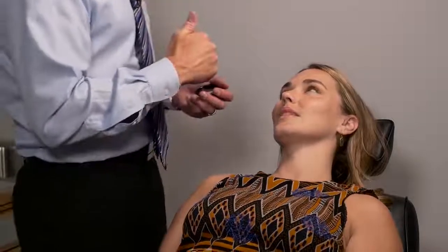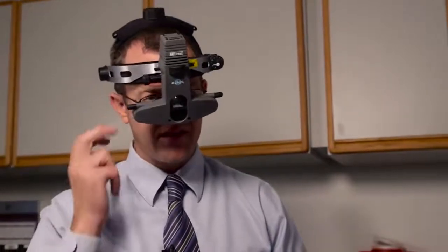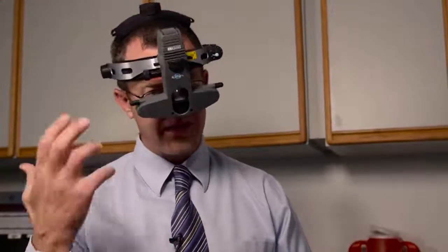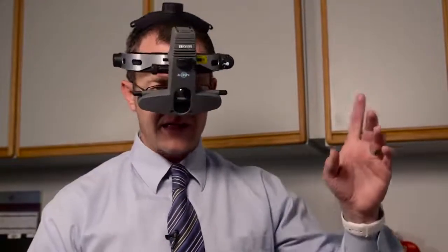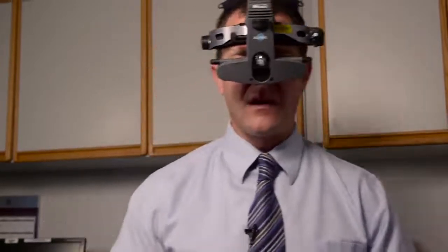As I'm going, I will make a note of where I saw change. Well, I saw a little retinal defect or a retinal tear up at 10 o'clock. In my head, I think retinal tear off at 10 o'clock. As I'm going, I've learned I'll kind of repeat that in my head. Okay, saw a tear at 10, and I keep going with my exam. Remember, you have a tear at 10, and that way when I get done, I'm going to record my findings. I'll write them down. But there's a lot of things to think about.